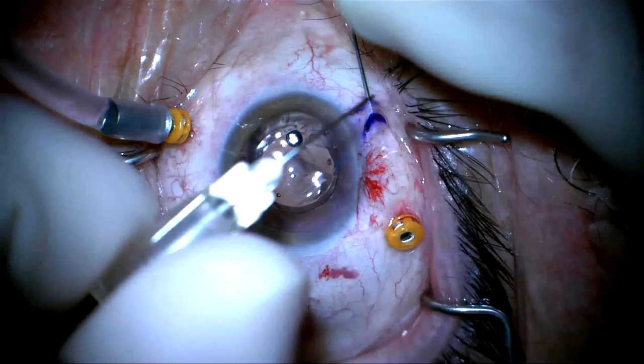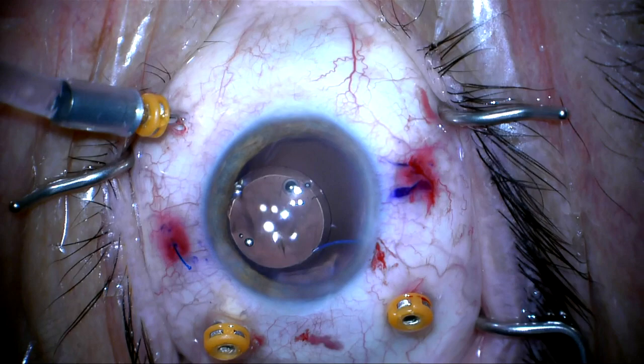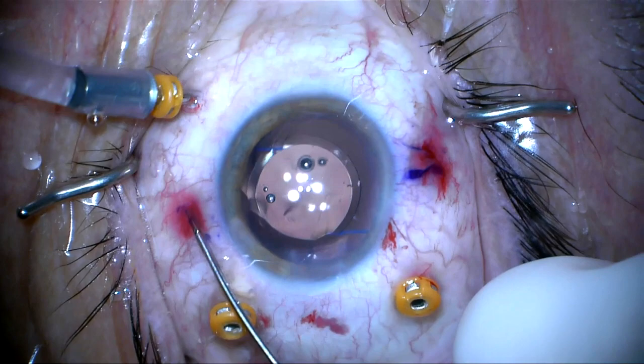Now I can melt each haptic tip. These are not large melts, but just big enough to secure the haptic in the scleral groove. We're going to push the haptics into the scleral groove on each side, and the lens centers pretty nicely.